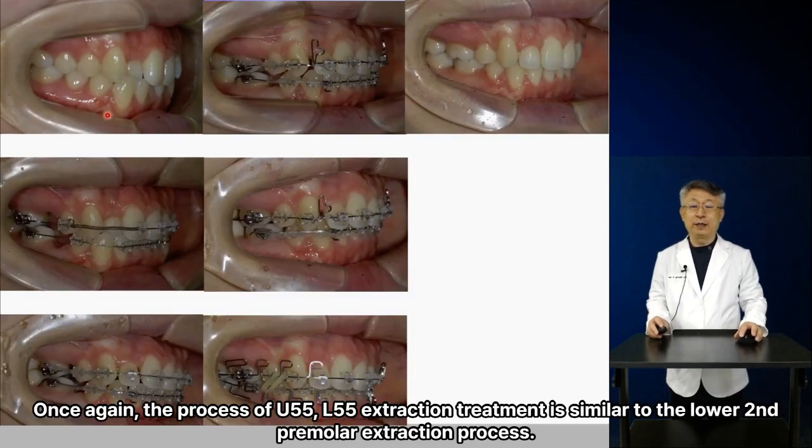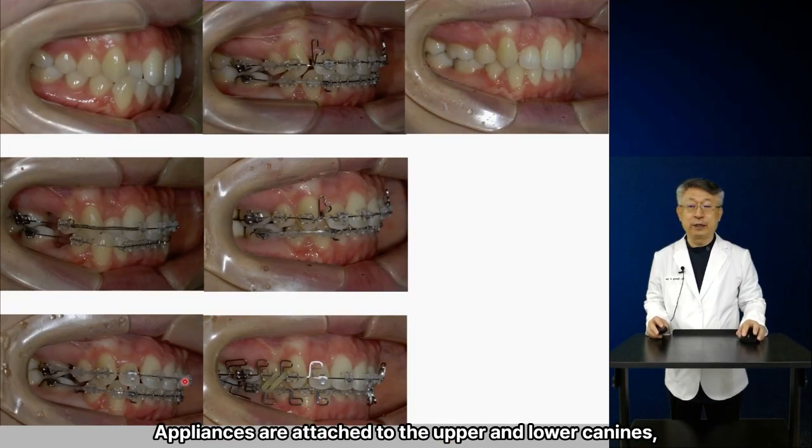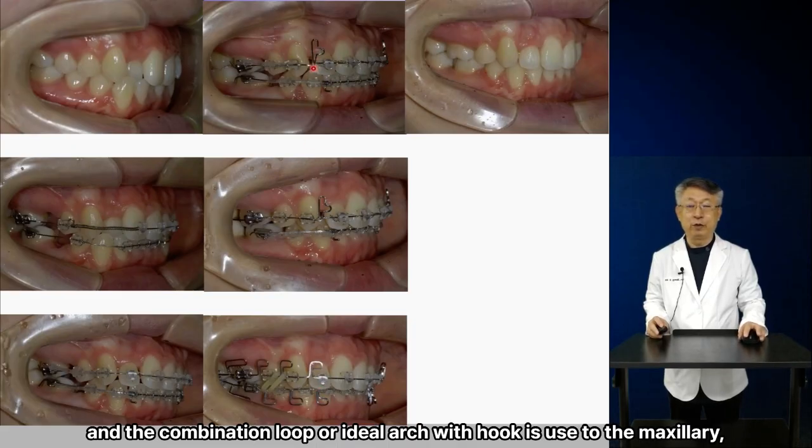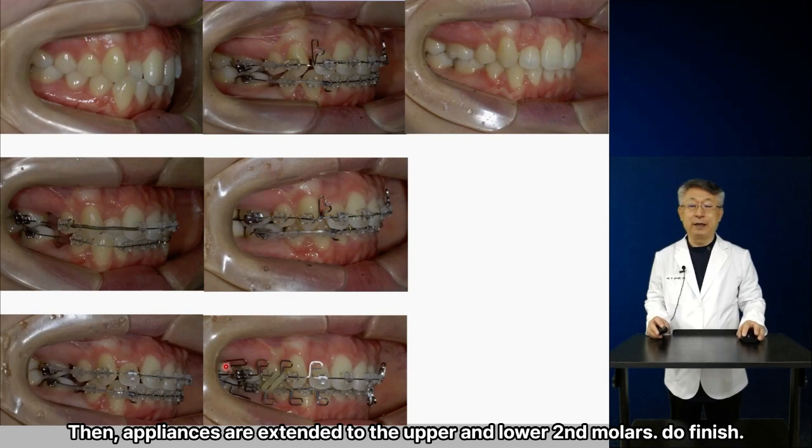Once again, the process of U55, L55 extraction treatment is similar to the lower second premolar extraction process. The important thing is that the upper first premolar must first be moved posteriorly. Appliances are attached to the upper and lower canines, and the combination loop or ideal arch with hook is used in the maxilla, and an ideal arch with hook is used to close the extraction space in the mandible. Then, appliances are extended to the upper and lower second molars.